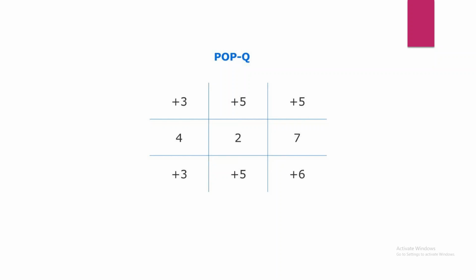C is within 2 centimeters. Suppose TVL is 9 and C is 8 and D is 6. If TVL is 9, how can D become 6? Because posterior fornix will always be deeper. When you are checking the discrepancy, you can tell that C is 3 or 4. That means you can tell it is cervical elongation.